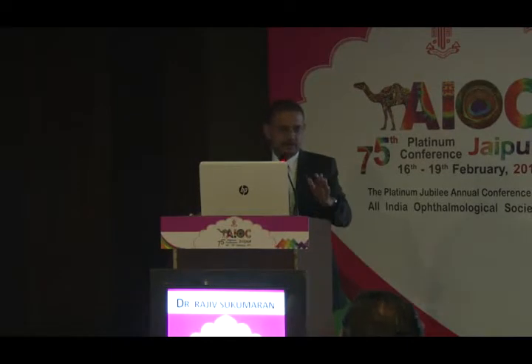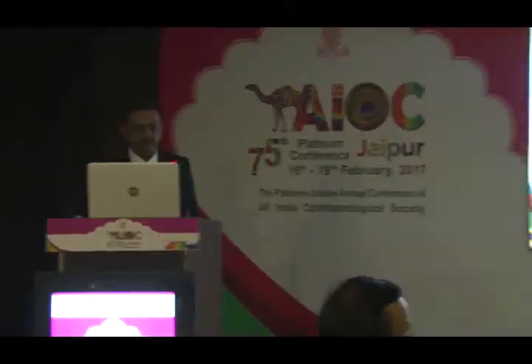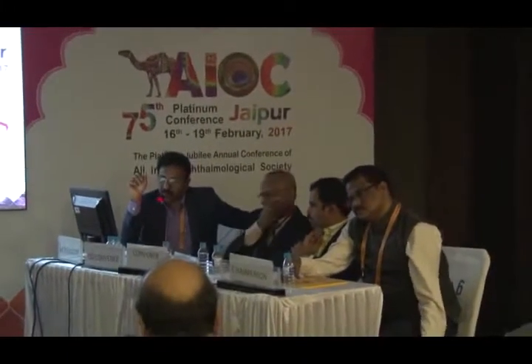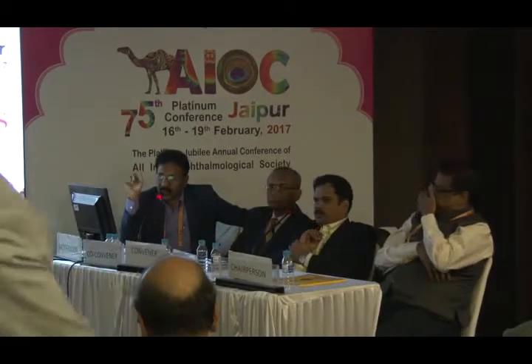That is possible only with the horizontal. Not only horizontal, even automated ones have all that. What about the vertical one? No, in vertical ones, the vacuum cycle is not there. And in the vertical ones, it is not uniform. The steam comes from the top, so it may not reach its fullest potential in the lower bin. So that's the reason why vertical autoclaves are not advisable.